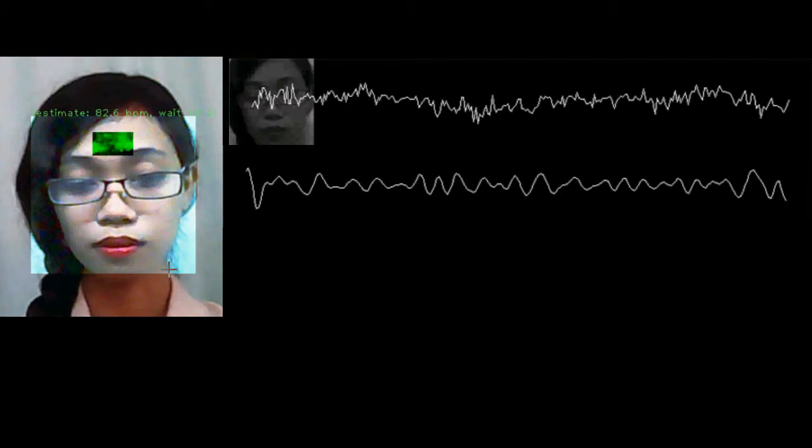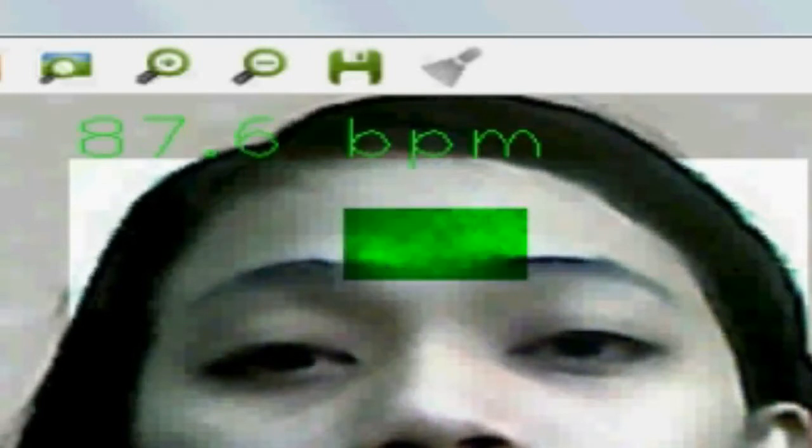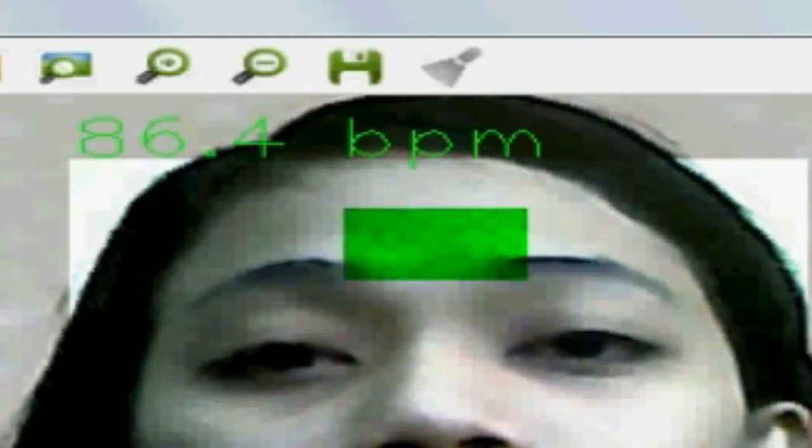Frequency powers are identified and heart rate is estimated by taking the most powerful peak in the range of 0.3 to 3 Hz. Real-time phase variation associated with this frequency is also computed, causing the highlighted region to pulse in sync with the user's own heartbeat.